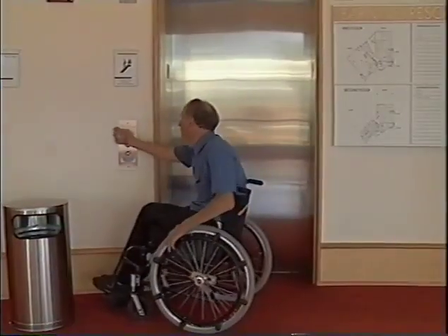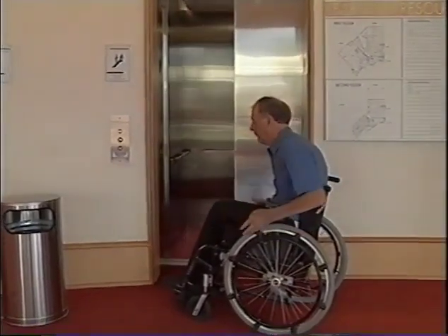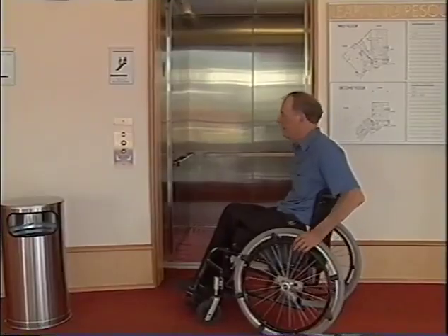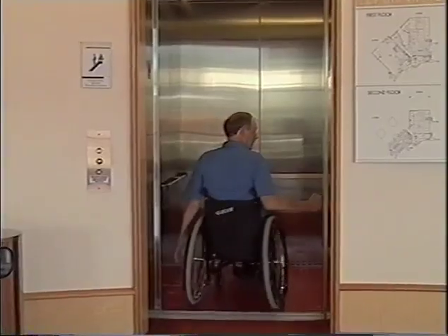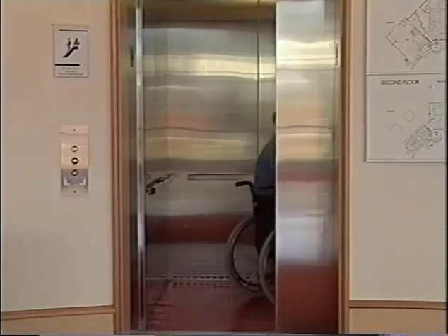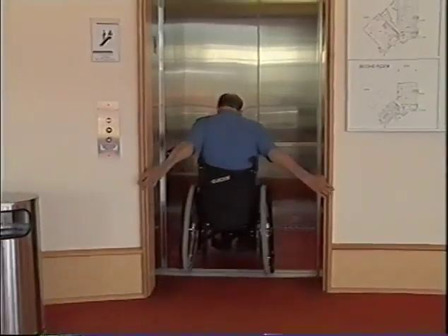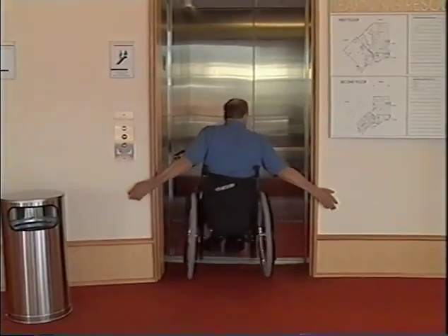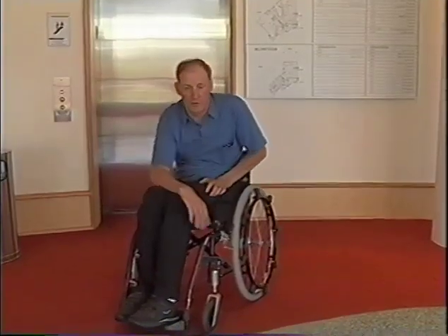Getting on elevators is always a questionable thing. Do you turn around before you get on or not? If you're having a hard time wheeling, I would just get on with your back to the elevator and worry about what comes, what may. Getting off the elevators, if you're having trouble backing up, you can sometimes pull yourself backwards out of the elevator, and that can save you some time and worry about everybody looking at you, and it's a tough time to operate.